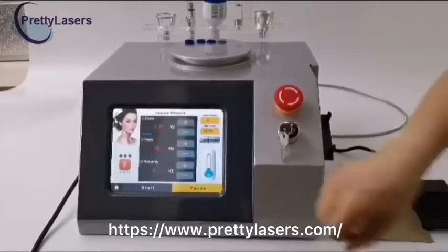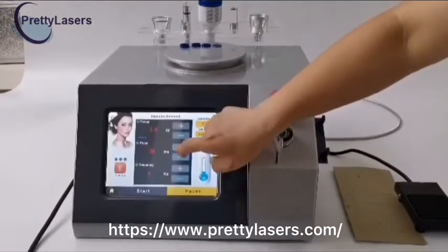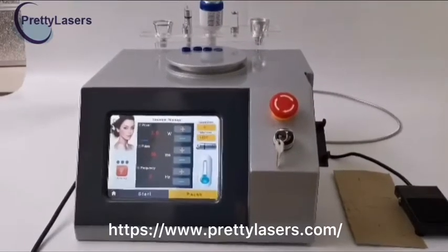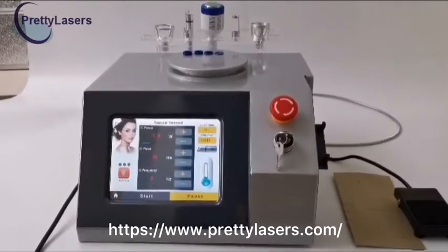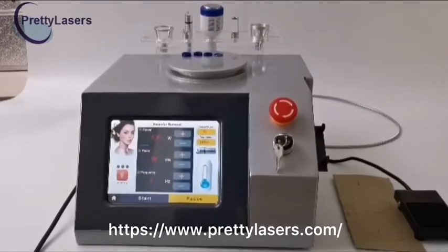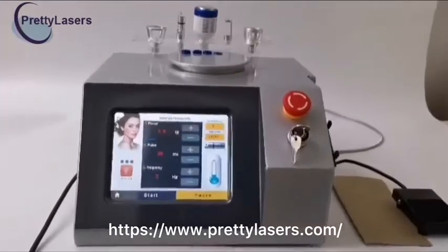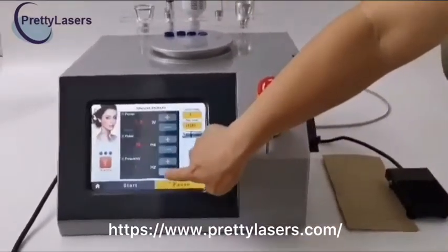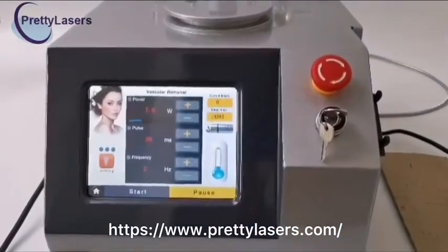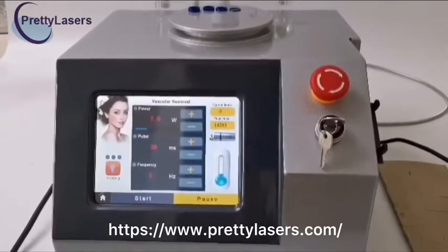The pulse width is the time that the laser stays on the skin. The minimum is 15 ms and the maximum is 100 ms. When operating on the skin, if it is too small it does not work; when it is too large, redness will increase and blistering may occur. The common range is 30 to 60 ms. The frequency is the speed — the number of laser pulses emitted per second. The minimum is 1 Hz and the maximum is 5 Hz.